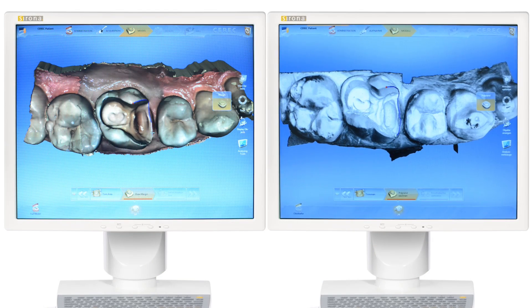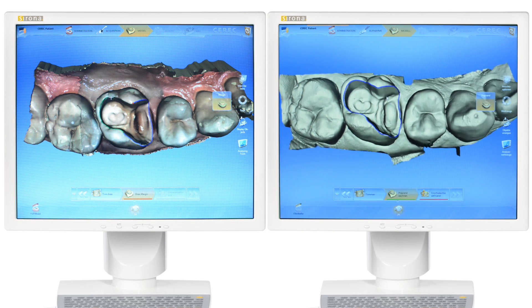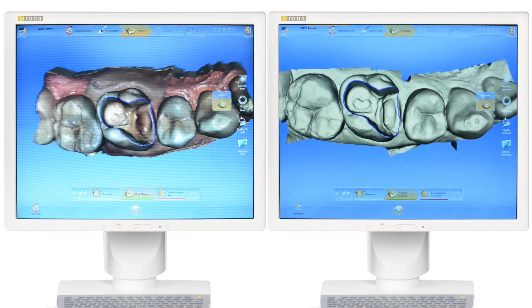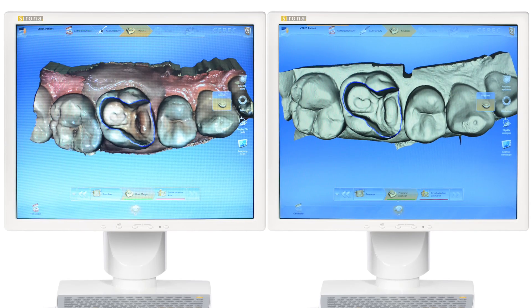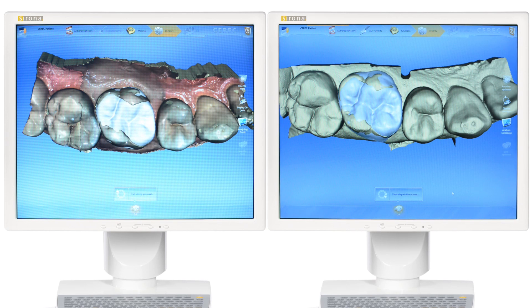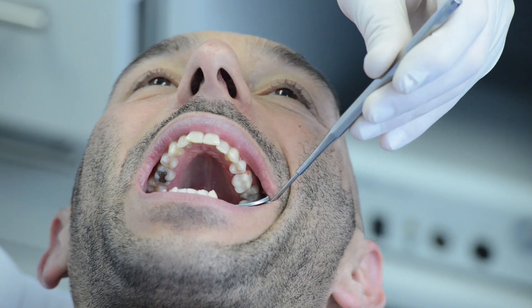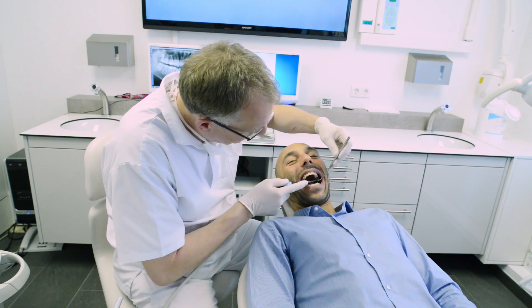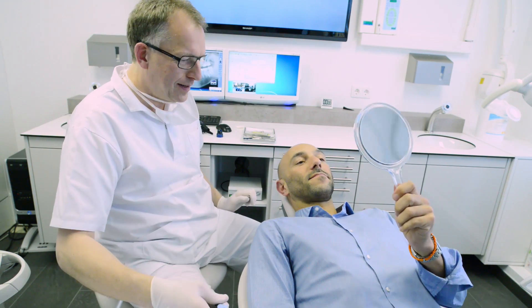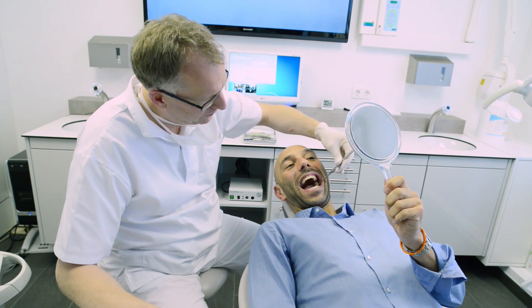After scanning is complete, the workflow for both cameras is essentially very similar. Virtual models created from OmniCam images are full color, an advantage for patient communication. With a single click, the biogeneric proposal with natural occlusal contacts is automatically calculated. Both cameras are easy to use and provide highly precise clinical results. You have the choice between two absolutely first-class camera systems.